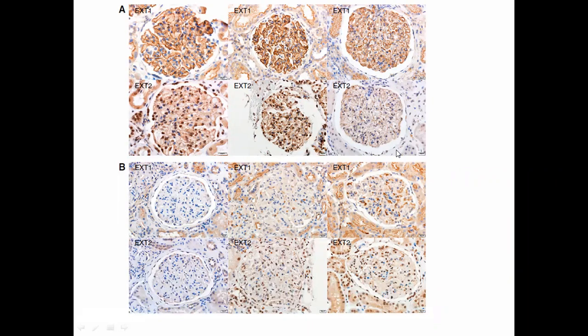So what he suggested was, if you find strong exostosin 1 and 2 staining, it is commonly seen with a non-proliferative lupus, and that too in membranous lupus. It will not be seen in a class 2 lupus. It will not be seen in any proliferative lupus. So if there is a class 5 plus focal proliferative lupus, that means there is membrane thickening, it is classical class 5, and there are a few glomeruli which are showing crescents. He suggested that those cases with a little bit of proliferative component also will not show significant exostosin 1 and 2 staining. So the role of exostosin 1 and 2 is mainly in membranous glomerulonephritis secondary to autoimmune diseases, not in any proliferative glomerulonephritis due to autoimmune disease or any proliferative lupus.